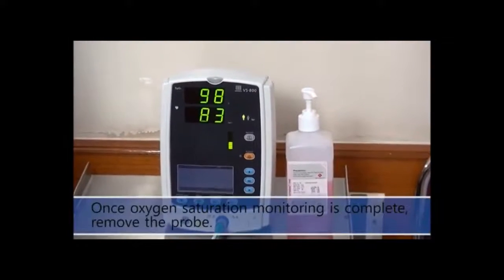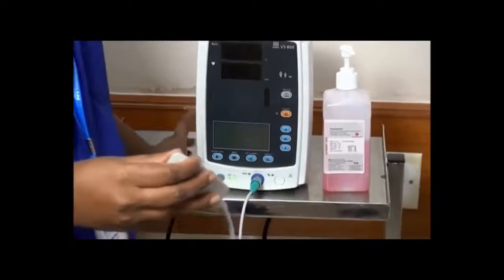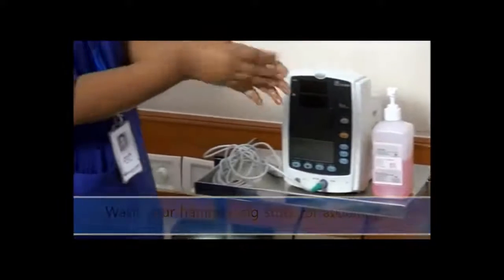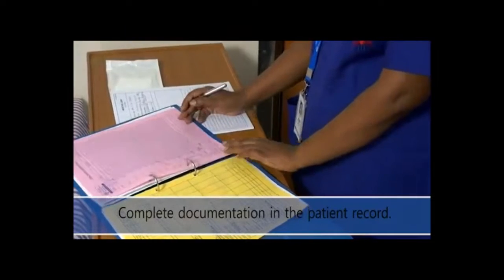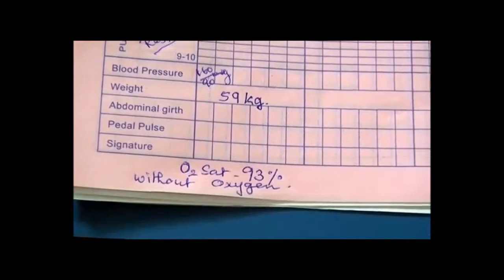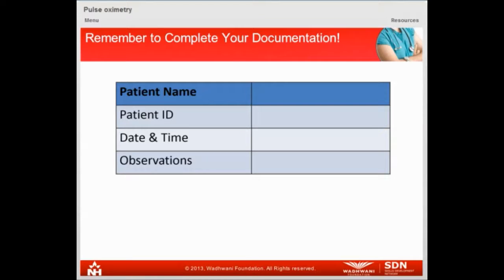Once oxygen saturation monitoring is complete, remove the probe. Wash your hands using soap or alcohol gel. Complete documentation in the patient's record. Always remember to complete your documentation after the procedure.